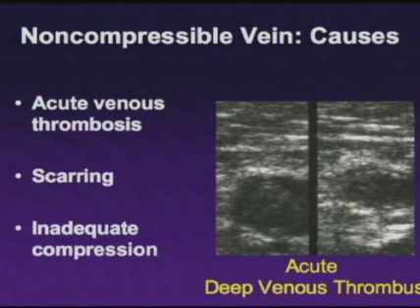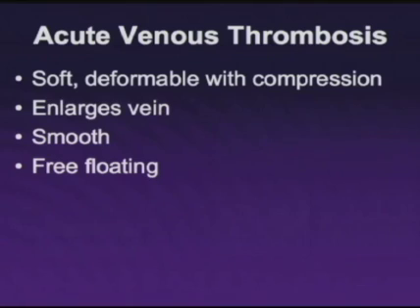but the vein may not go away for other reasons besides that. There could be scarring in the vein and material in the vein that is not acute, and the vein would not go away, or that the technical factors where the vein was not compressed adequately.